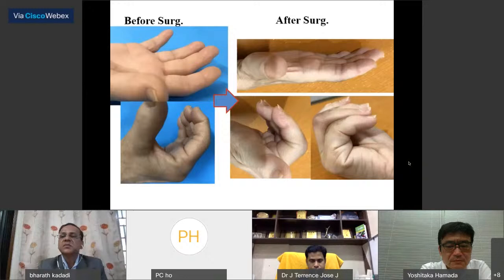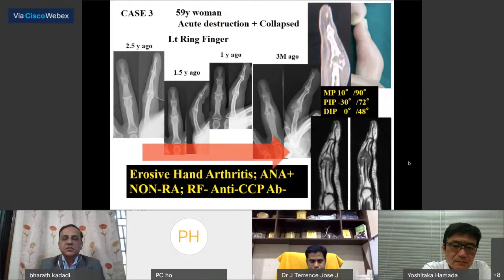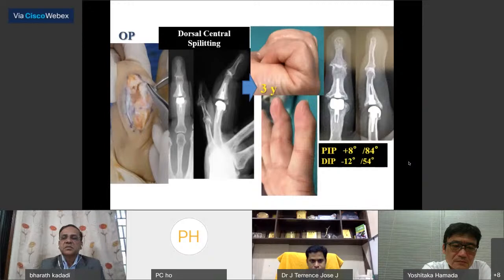This erosive hand arthritis showed acute destruction and collapse within a few years. This kind of case can also be well treated by the dorsal central approach. Bone fragments could be well corrected with a wide view. In such a case, the improved arc has been well preserved for more than 3 years.